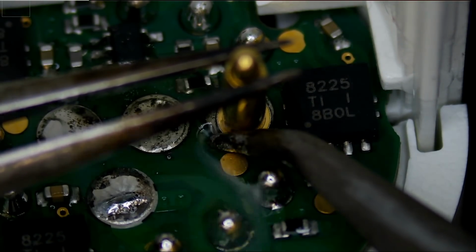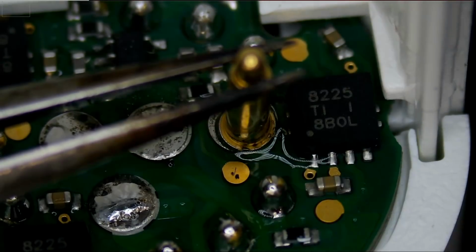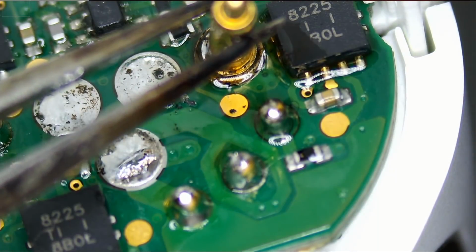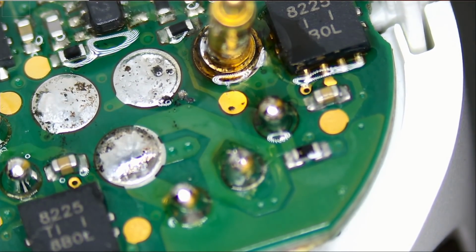Let's see if we apply our soldering iron right there. Done. The first one is done. All right, so that one is solid. Very nice. We're gonna clean up later. Let's solder the other one.